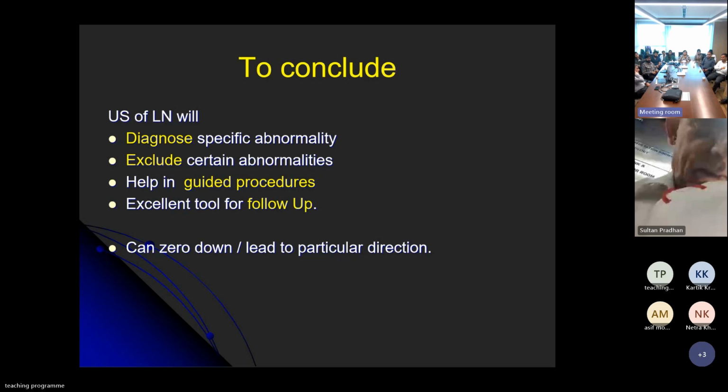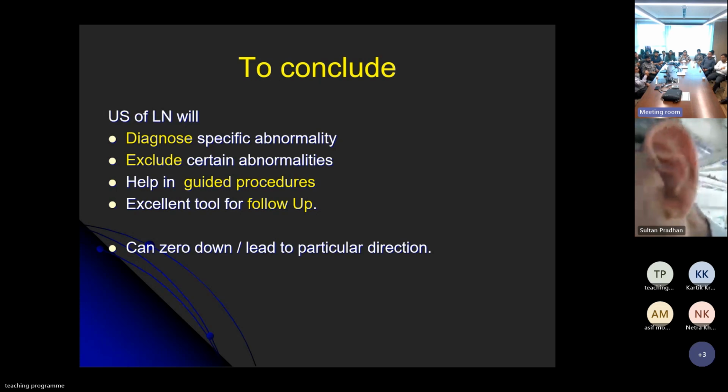Suppose it's a posterior, higher up level 5A node, you tend to miss it because the patient has not been turned around enough, or a node just below at level 4A or supraclavicular. Those nodes are missed, so the yield would be less. But if you use it correctly and document each level, nowadays anybody doing ultrasound in our department should show those pictures in 2 planes compulsorily, then we don't miss those nodes. I think that's the only reason.